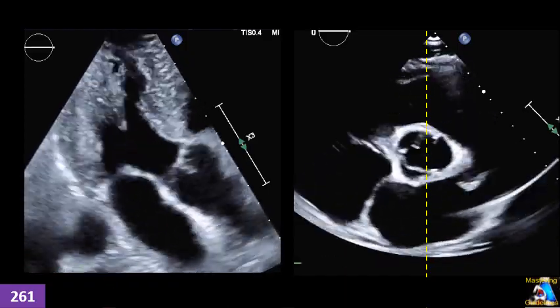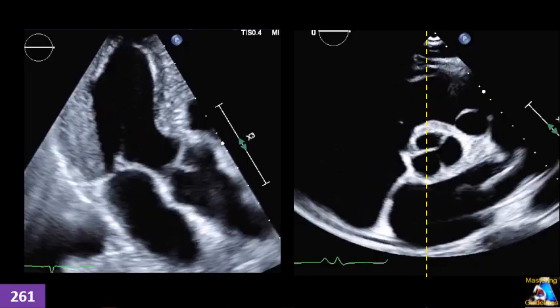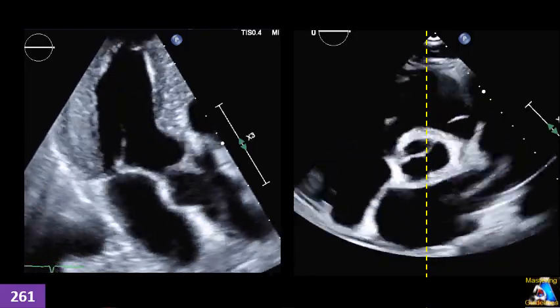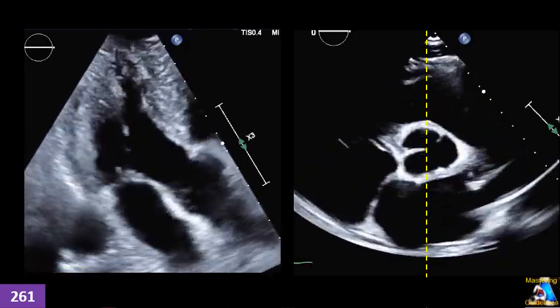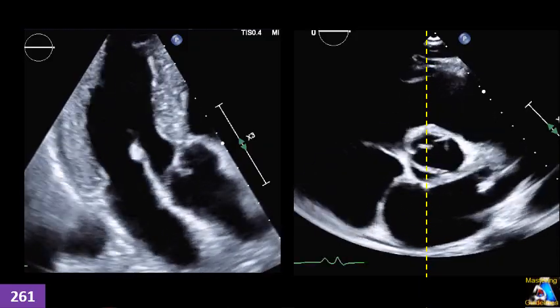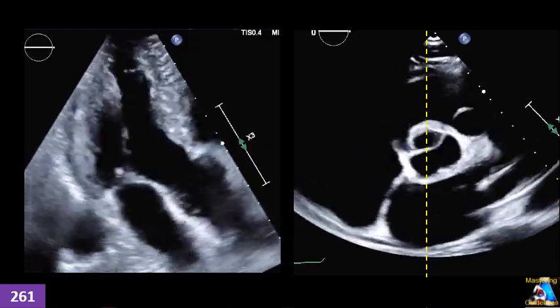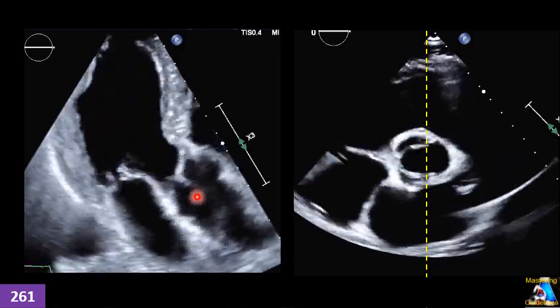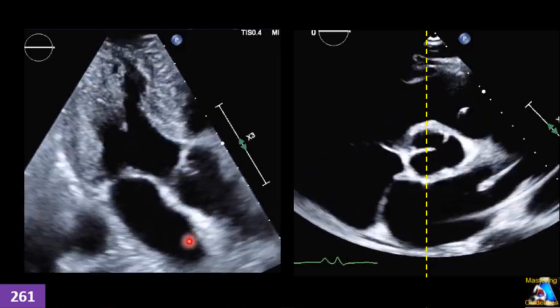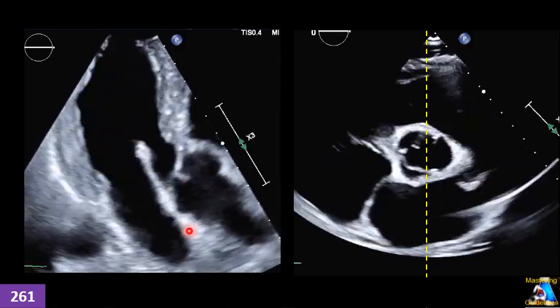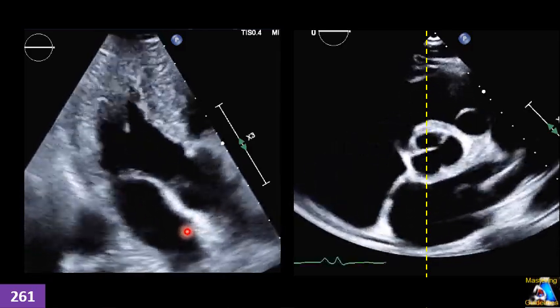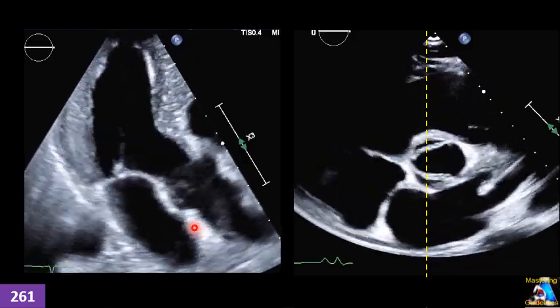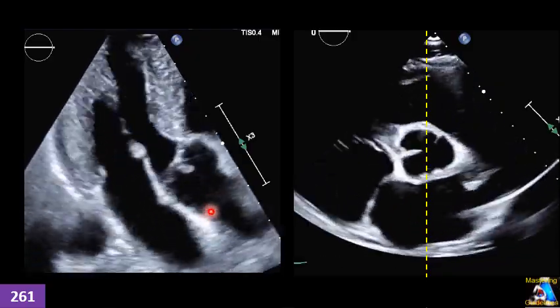What about this one? We don't have a parasternal view, but we do have an apical window. We have a good apical view like this. Can we measure the LA diameter AP on this apical view in this specific case or not? If we can, how do you measure it?